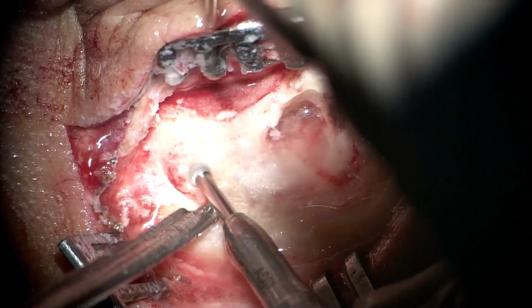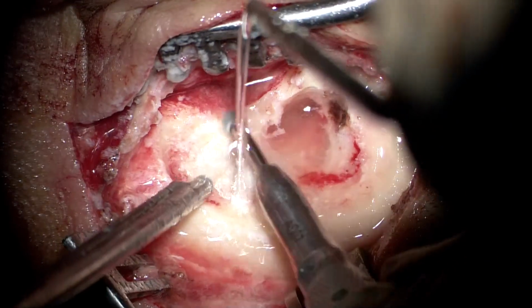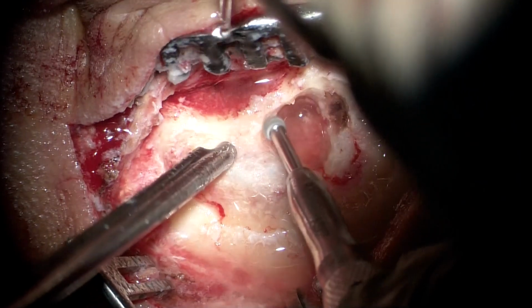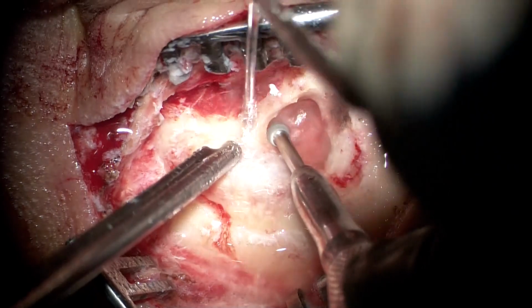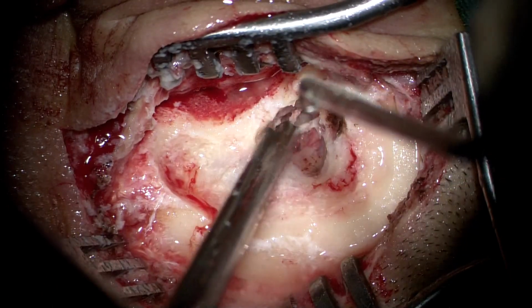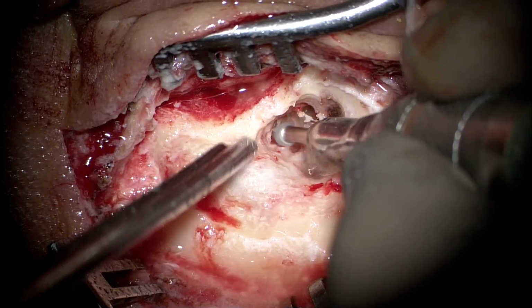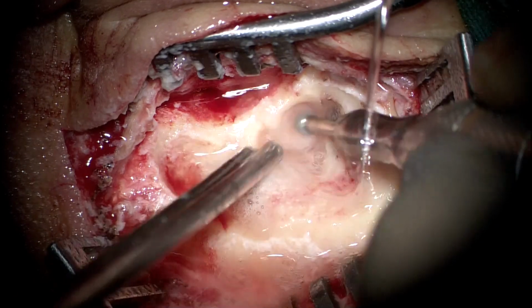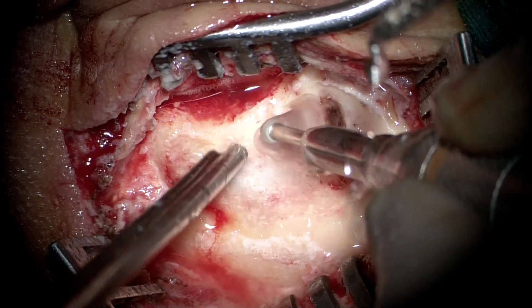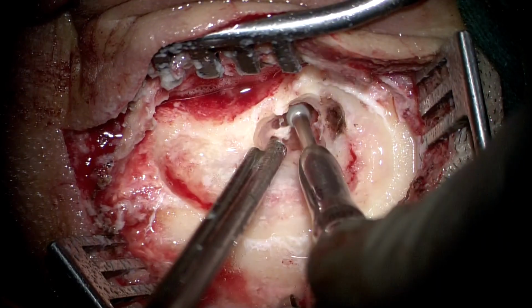A good exposure of the sinodural angle, although it is important in any patient in whom we plan to do a transmastoid labyrinthectomy or translabyrinthine approach towards the internal auditory canal, becomes much more important when the mastoid is relatively poorly pneumatized and sclerosed, because then every fraction of a millimeter of bone exposure that we achieve is fundamentally important to ensure the success of our main surgery, which is labyrinthectomy in this situation.